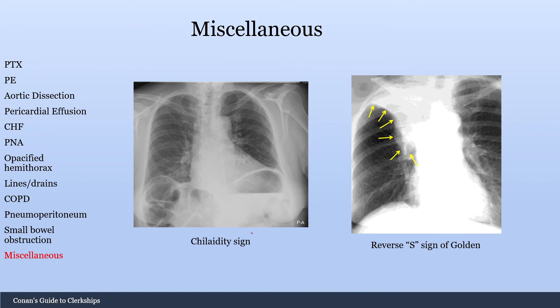Just some miscellaneous signs — here is the Chilaiditi sign. This is when a loop of bowel actually transposes over the liver. It can cause some pain, but generally it's asymptomatic. It's pretty rare, but you may see this. It's one of the reasons why if you're getting a liver biopsy, it's good to have image guidance so you know there's no bowel overlying the liver, and you're not going to perforate it by taking a biopsy through a piece of bowel.